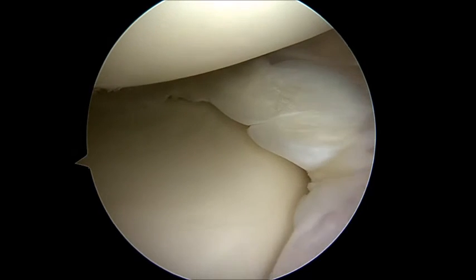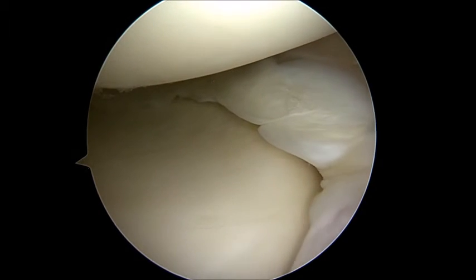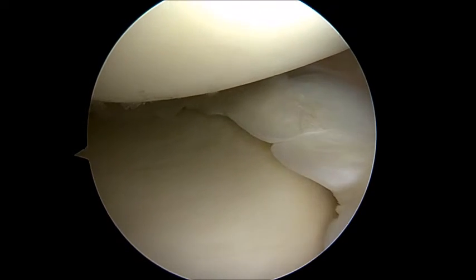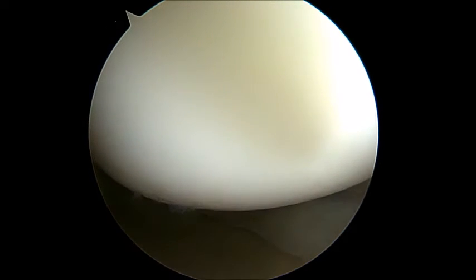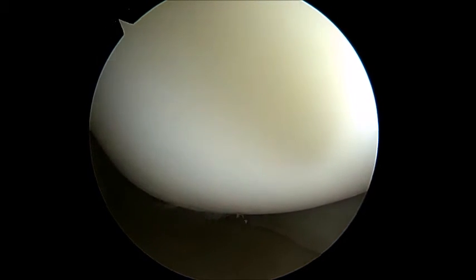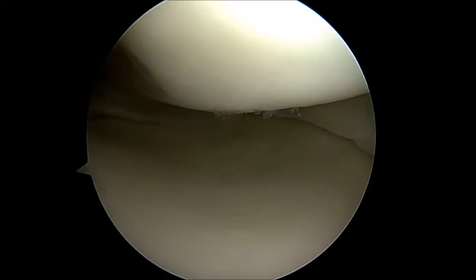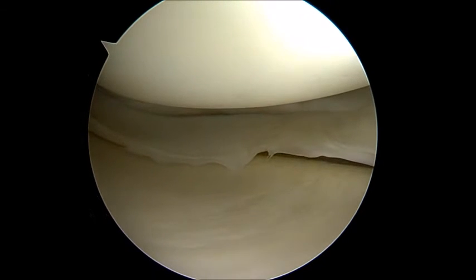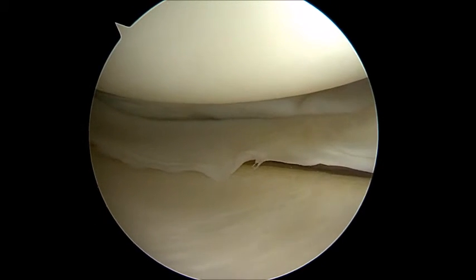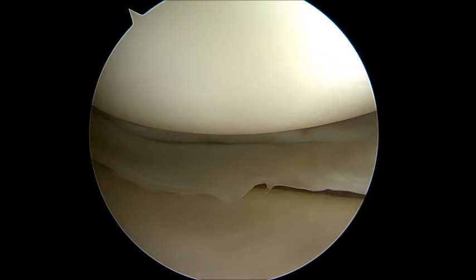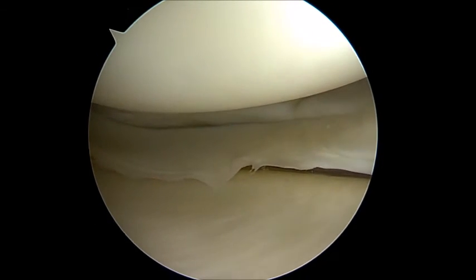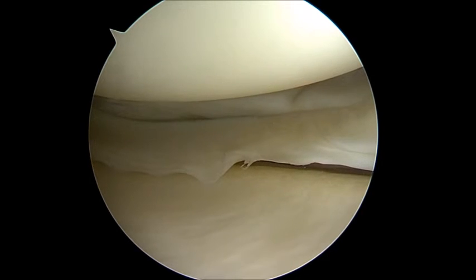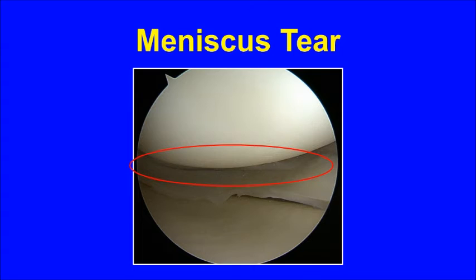Initial inspection shows that the front of the meniscus is unremarkable, the cartilage of the femoral condyle appears normal, and the cartilage of the tibial plateau appears normal. Further inspection in the back shows a tear in the posterior portion of the medial meniscus seen here. Here is a still photograph showing the meniscal tear outlined in the red oval.